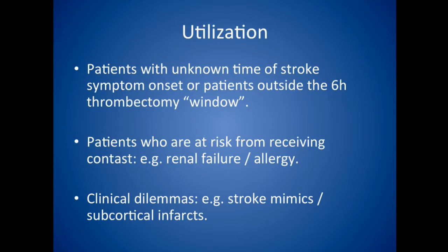And finally, there are clinical dilemmas that are pretty much impossible to solve on CT alone. Only MRI can really show these tiny little strokes, and also it's very good at ruling out all these different stroke mimics, including seizures, but also malingering syndrome, things like that.